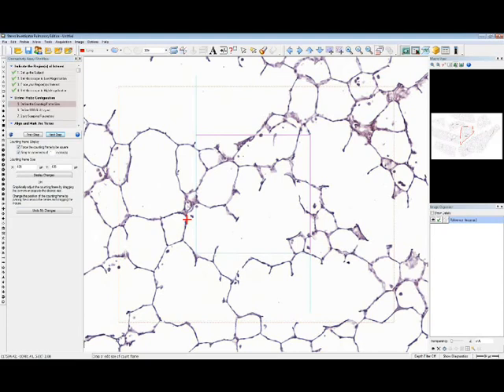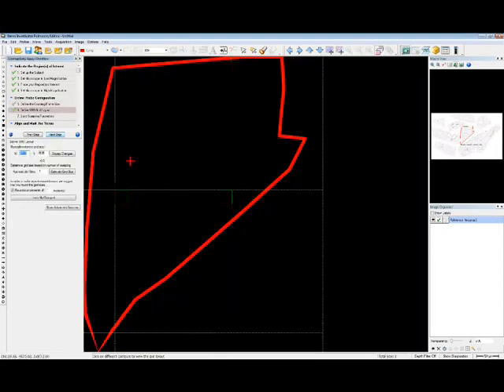The way you want to generally set up the dissector is you want to limit user error. So you want to make it small enough where you only count a few objects in it, and you also want to be able to count efficiently. And you will notice as we proceed, we'll all be looking at different parts of the same dissector, which is why it's so small: we want to make sure we're not missing any points to count. So we'll proceed to the next step.